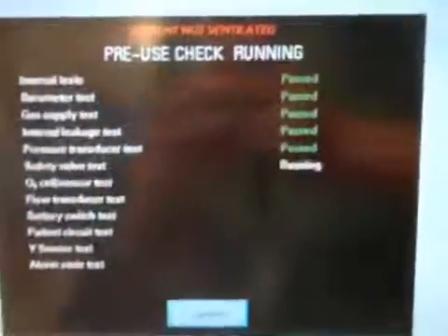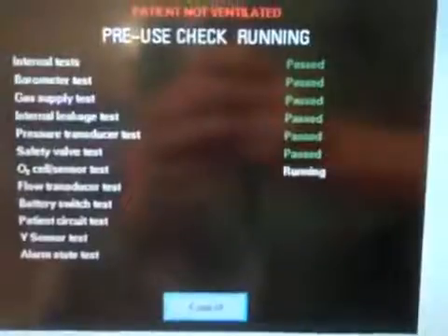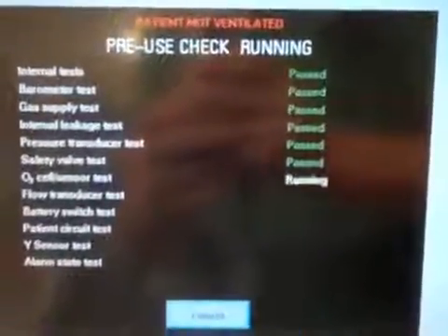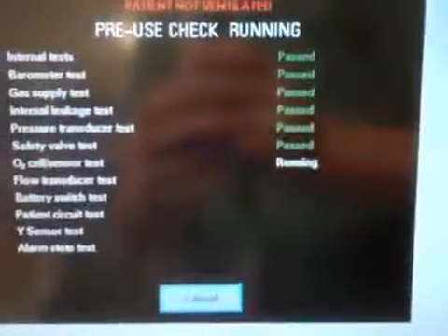Everything is going well so far — I'm getting passes. You can hear it going through its checks, pneumatically powering the circuit and internal components. Now it's doing the O2 sensor test, and I fully expect this to fail since the machine isn't plugged into oxygen. There we go — oxygen sensor fails, telling me to check the gas connection. If I redo the test it will still fail, so I'm just going to cancel out of it.